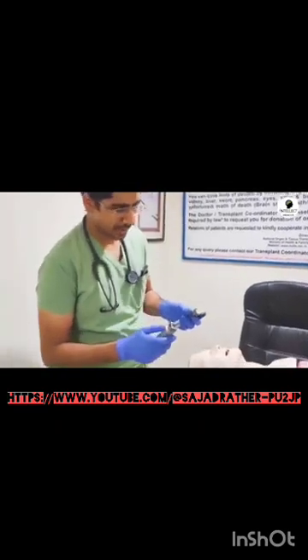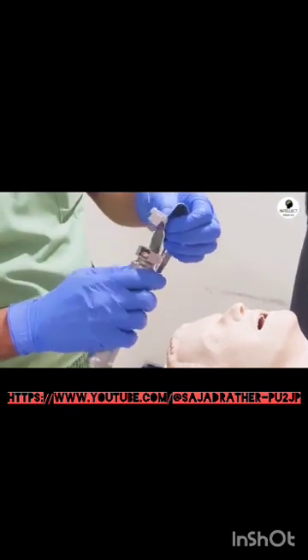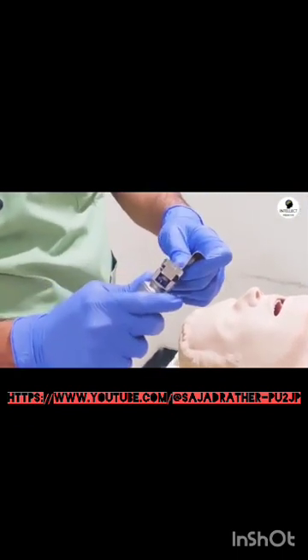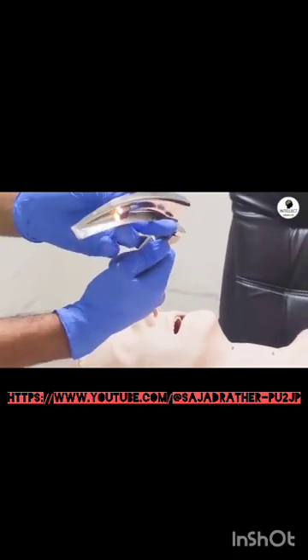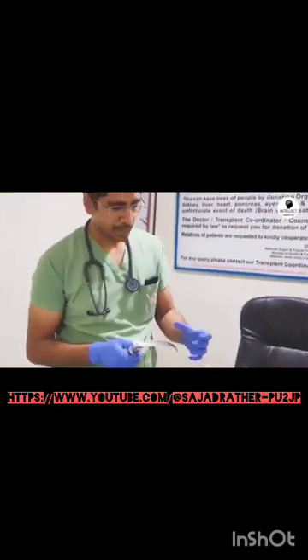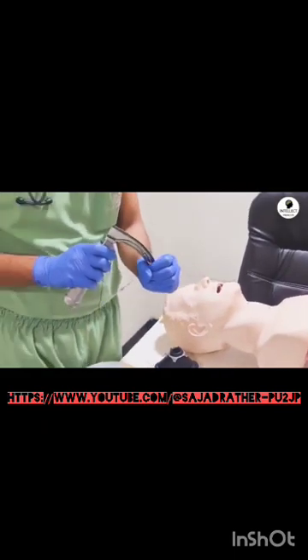Now, how to use it? This is a very important step. There is a groove over here in the handle, and you just have to insert this blade like this, and then straighten it like this, and there will be a light. Now you need to see whether this light is adequate or not. How to check it? If you are able to see the creases of your hand with this light, that means the light is appropriate.